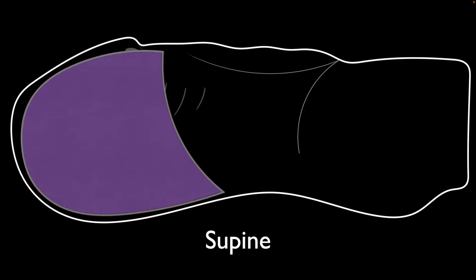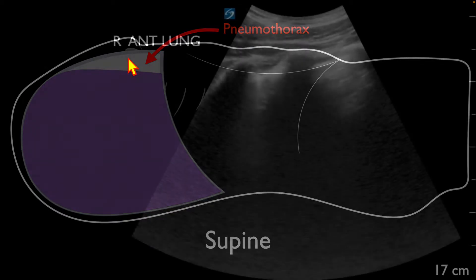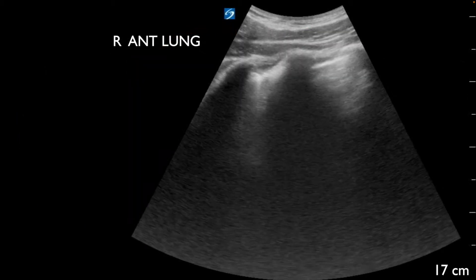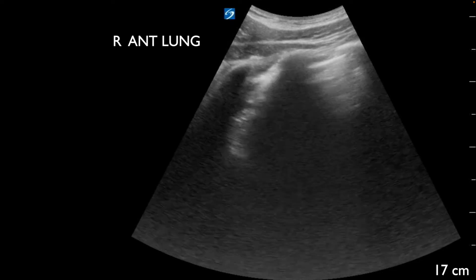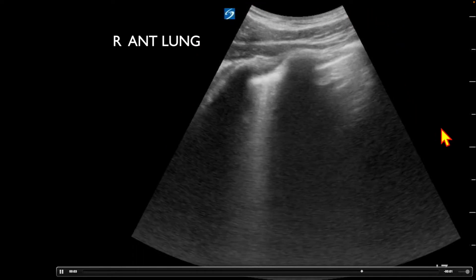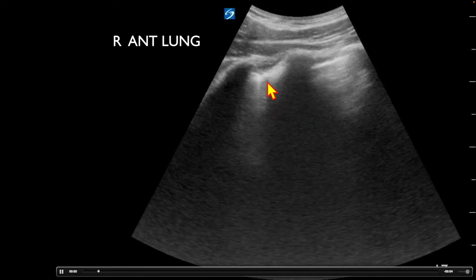When a pneumothorax develops in a supine patient, it's typically going to be anteriorly that we see this. We'll see that there is a separation of the lung from the anterior wall, as air will typically collect anteriorly. So when we look at this case and go through the different views, right here we have the anterior right lung — superior towards the head and inferior towards the feet. We see a rib here, rib here, and rib here, and we're going to evaluate these pleural lines.